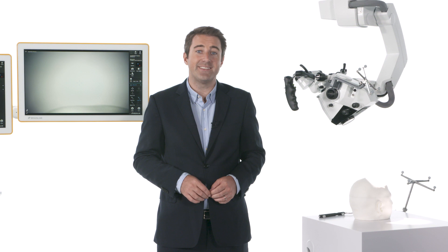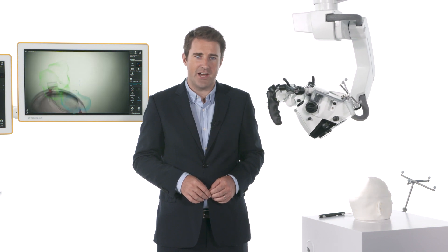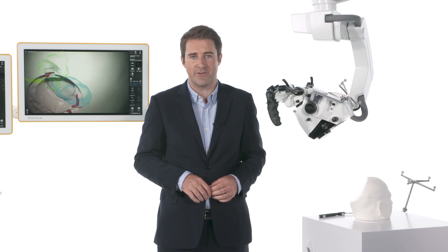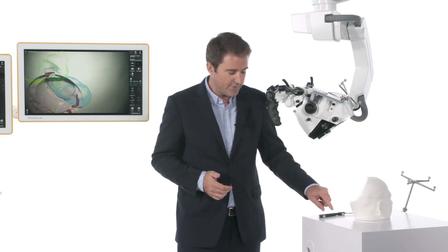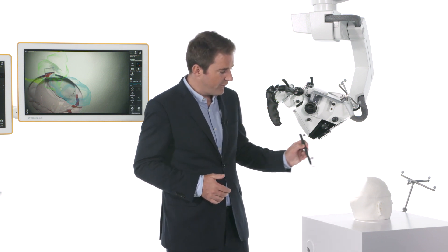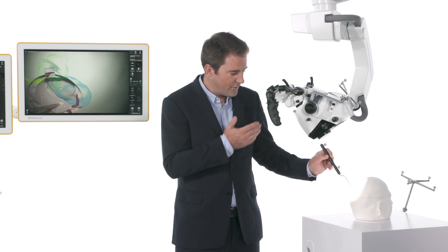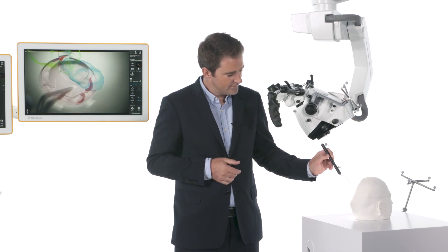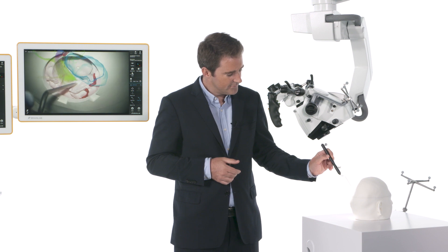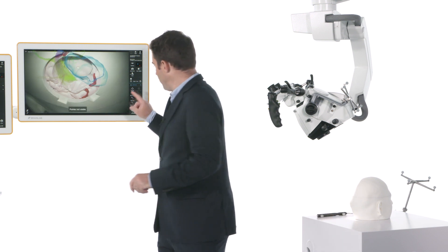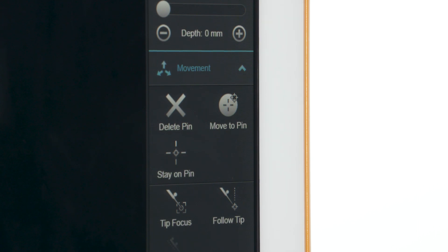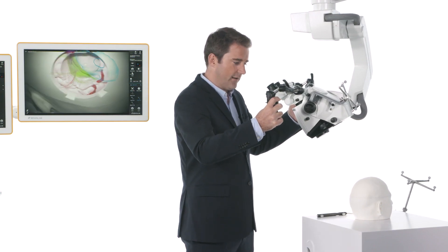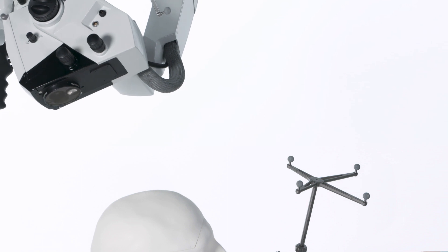Microscope navigation works in tandem with Zeiss Kinevo 900 for navigation-aided robotic alignment in six degrees of freedom. While exploring the surgical cavity, the microscope follows the navigation pointer and focuses on its tip. Setting a pin defines a landmark for the microscope to return to at any time during surgery, even if the OR table is moved.